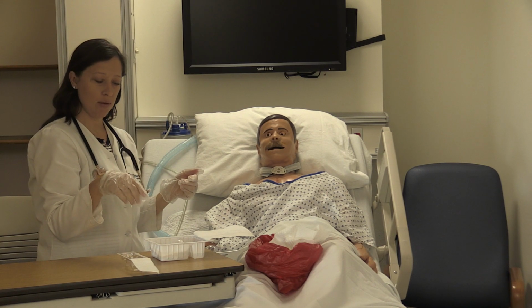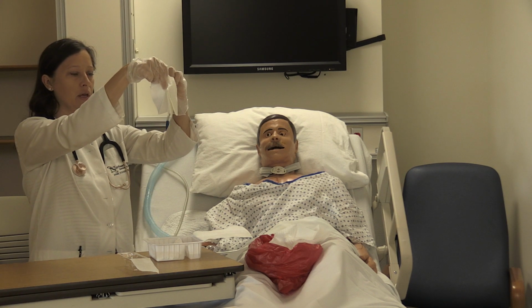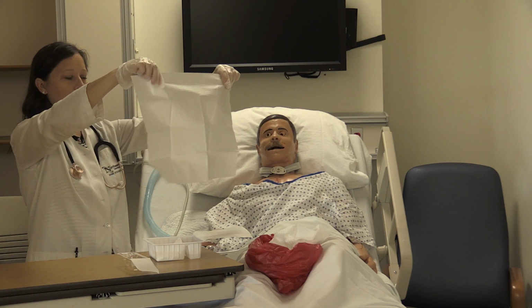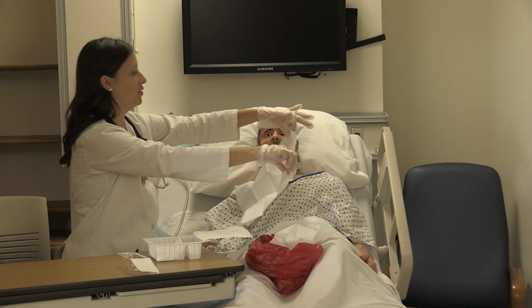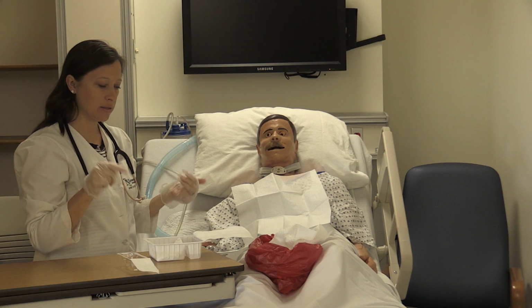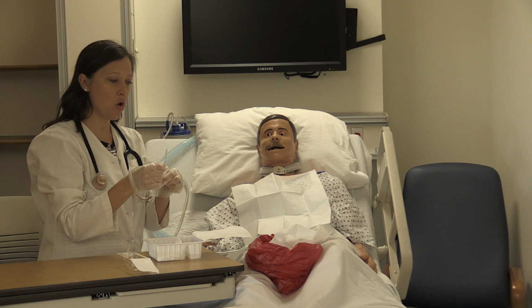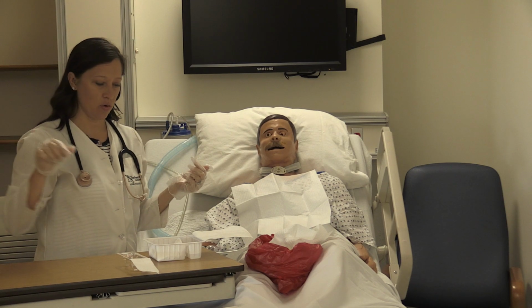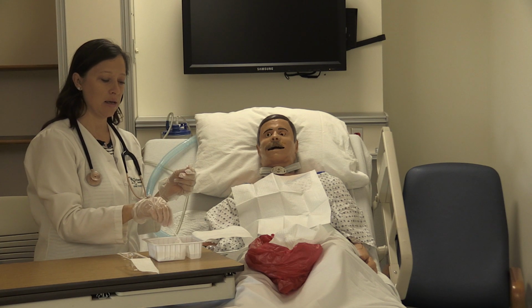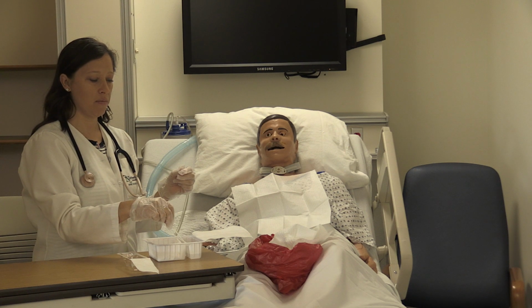There is actually a sterile drape in this kit, so I'm going to go ahead and pick that up. Just make sure you pick it up so you don't drag it across the edge. And you just kind of lay that wherever it may be. And then you want to inspect your supplies. So what you have here is just some things that you don't need. We have like some pipe cleaners. We don't need that. There's 2 Q-tips in here that you'll use for cleaning, but we'll actually use like 6 of them. So you want to dip it in the water.